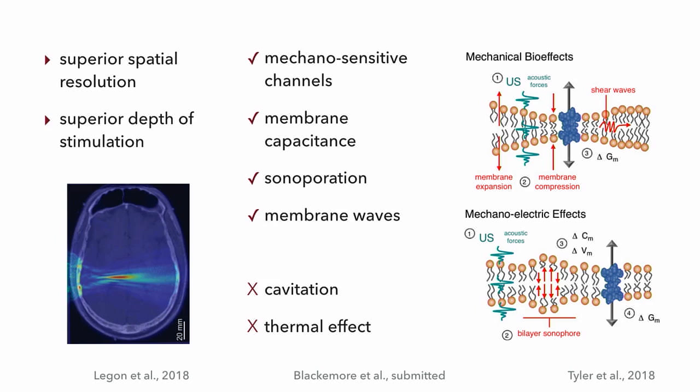It's a very active field of research on what the mechanisms of ultrasound are and how it modulates neuroactivity. But for now, I think it's important to mention that there is no evidence that at low intensities there's any effect of cavitation or thermal modulation, but actually that most evidence is here for a mechanical interaction on membranes, changing membrane potentials.